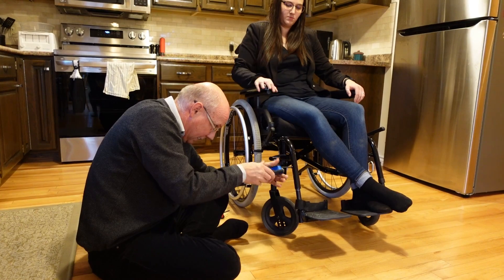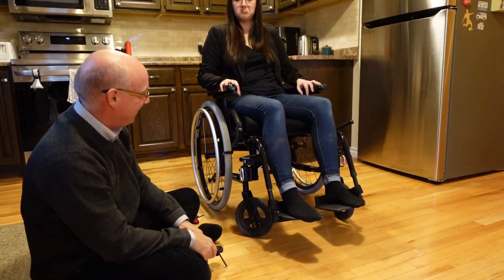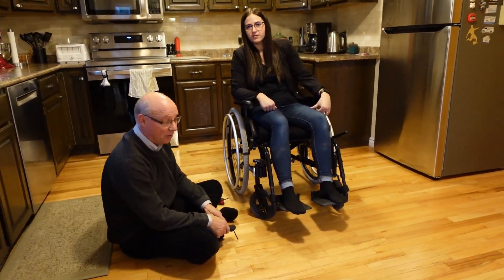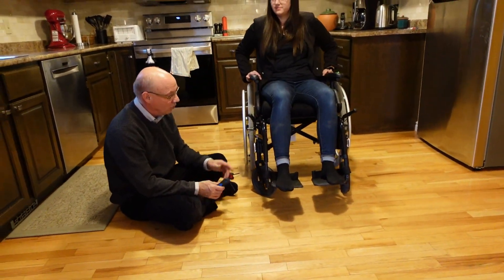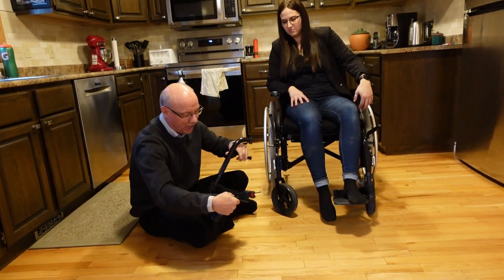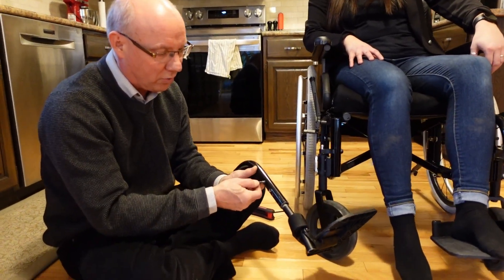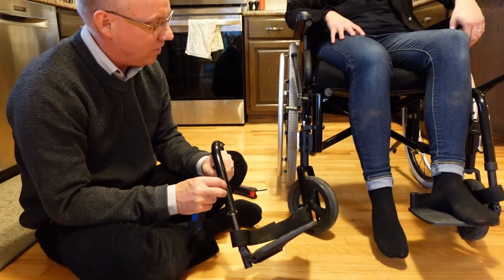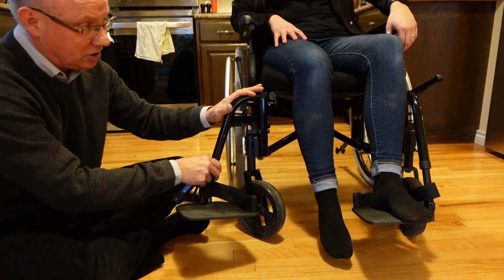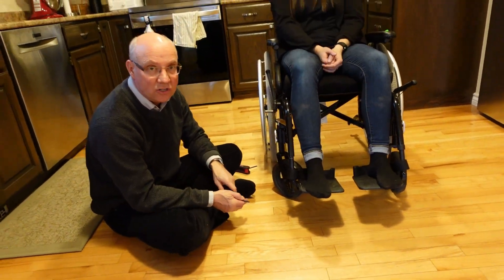Put your foot on there now — let's see how that fits. Perfect, good level. So that is how you adjust footrests. You could actually take them off — some people don't want to do it on the chair. You can undo it, take the footrest off, and work with it that way. So you've got a couple of different options. Just make sure you try to keep the leg nice and level, depending on what cushion you're sitting on.